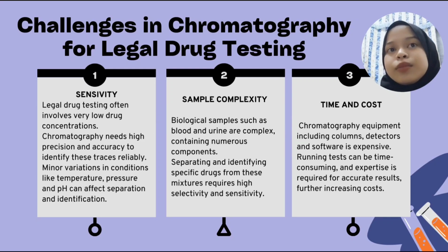I will continue about challenges in chromatography for legal drug testing. First, sensitivity. Legal drug testing often involves very low drug concentration. Chromatography needs high precision and accuracy to identify these drugs reliably.